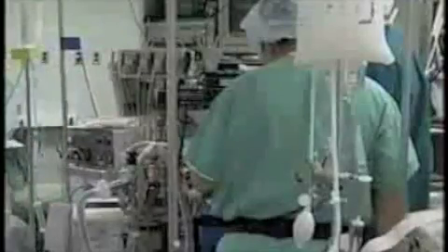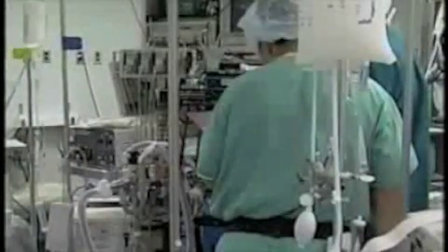The use of the devices, the manufacturer often considers it for a specific indication, but once it's out there in the world, the indications often expand so that the user population and environment of a device's use typically expands significantly after it's released. One of the most important problems we have in the operating room is delivering sterile supplies to the field, and therefore packaging becomes a very significant problem when the design is such that we have difficulty opening the product.